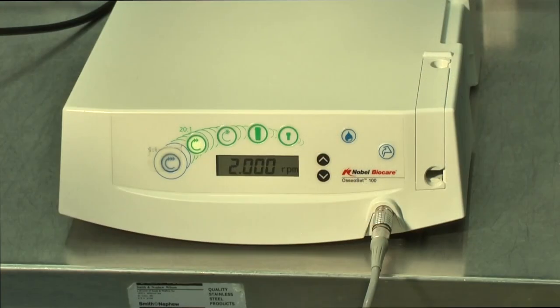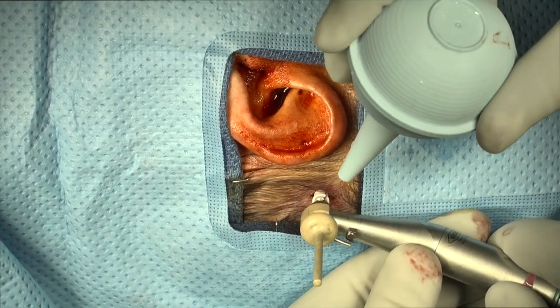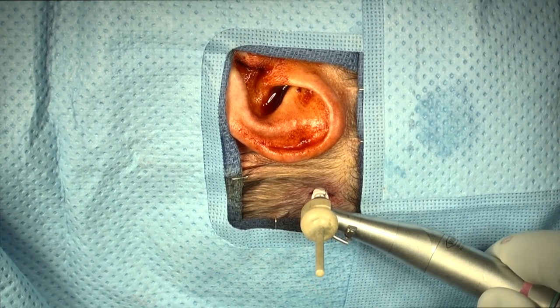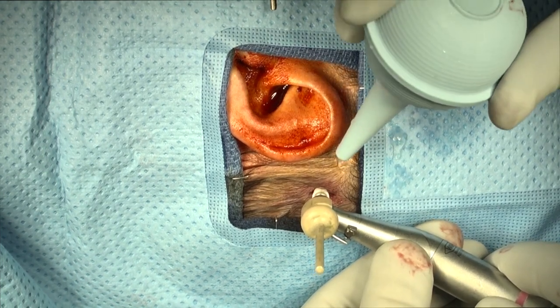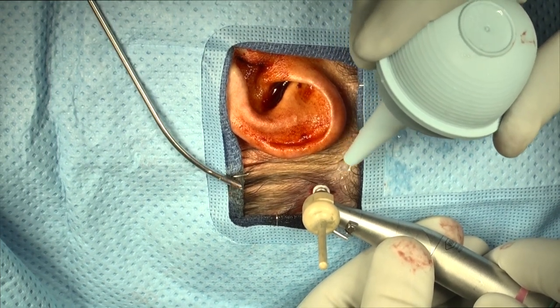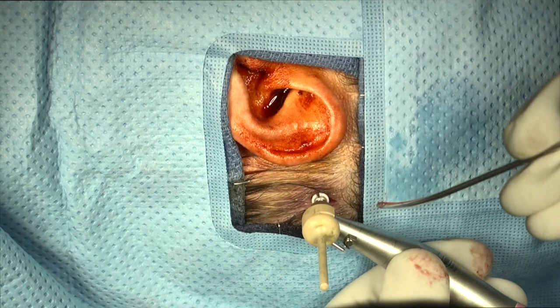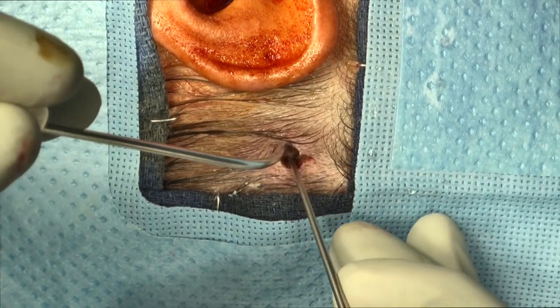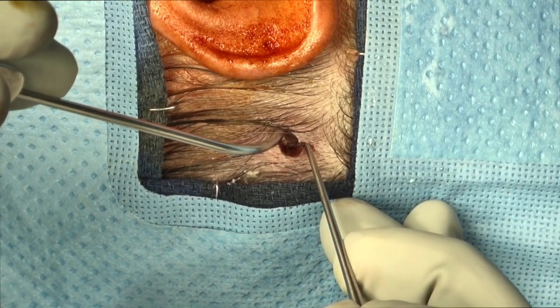The drill is set to 2,000 RPM. The 4 millimeter drill guide bit is attached to the drill along with a 3 millimeter white spacer. It's very important to drill as perpendicular as possible — placing a drill guide on the back of the drill can help with this. Drilling is performed at 2,000 RPM with heavy irrigation and should continue until the white spacer touches the underlying bone. Following this, the depth of the hole should be palpated with a thin blunt instrument such as a gimmick to ensure there is no exposed dura before removing the white spacer and proceeding with the 4 millimeter drill.